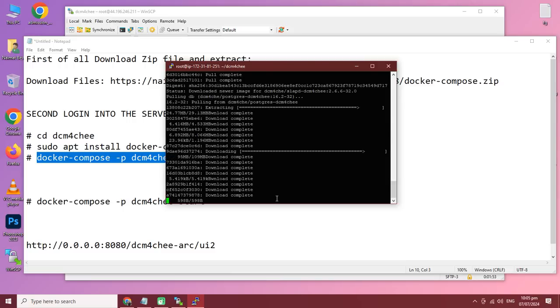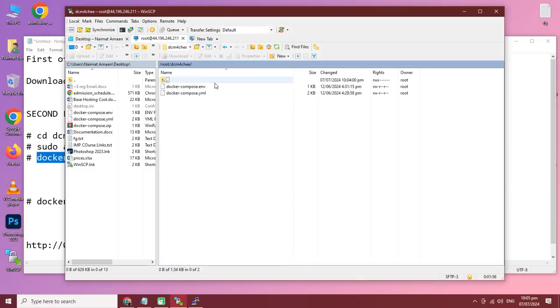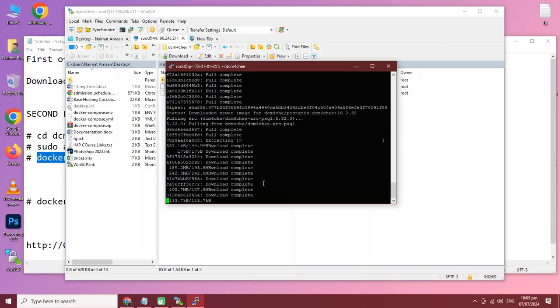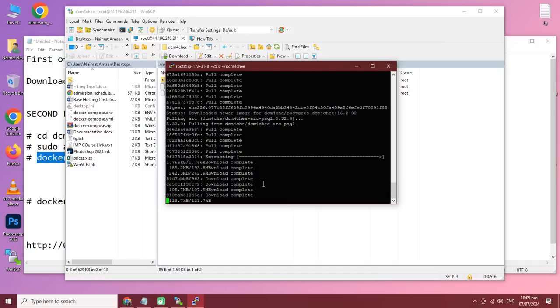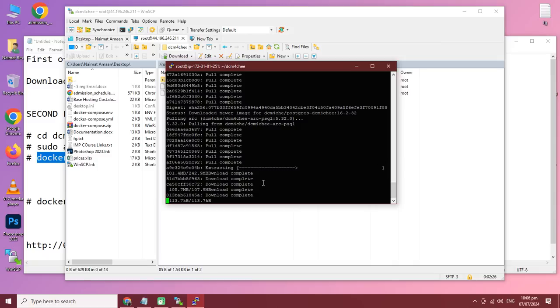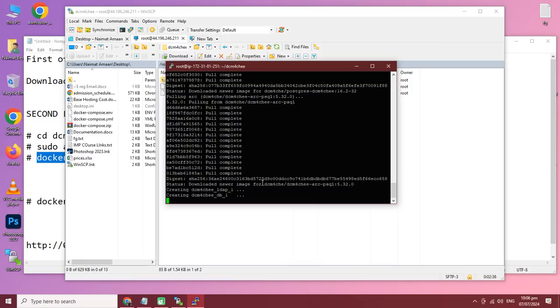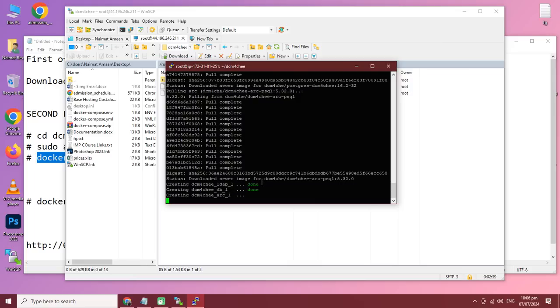DCM4CHEE is now downloading from Docker. All these settings are already written in the two files, so you don't need to edit them. It will automatically download and install everything related to DCM4CHEE. Just a few simple commands — download the file, put it in the DCM4CHEE folder, install Docker, then install DCM4CHEE with the Docker command. You can see the files downloading, and once complete it shows 'done' for each component.